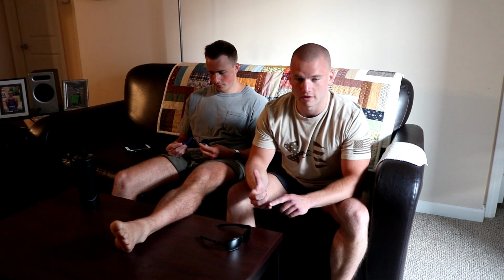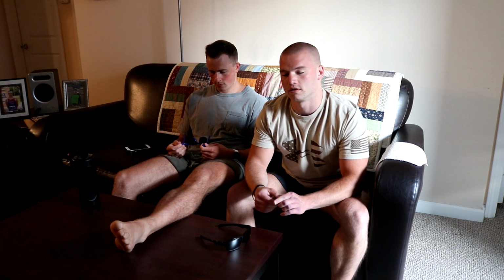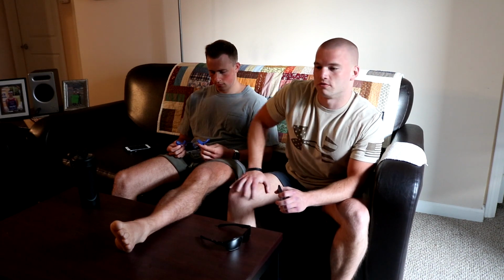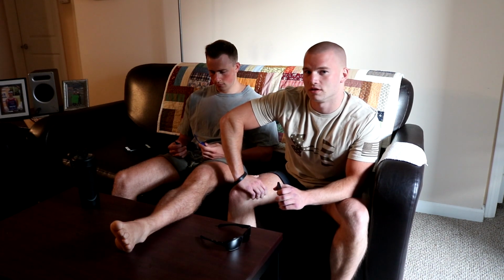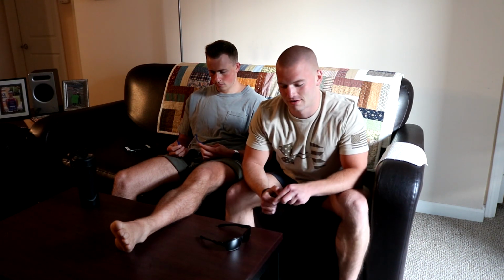Malignancy of any type, radiation therapy within the last 4 to 6 months. You also don't want to apply it over any hemorrhages, the thyroid gland, or other endocrine glands. And then some precautions include if your patient is pregnant. If you're using this on a child who's still growing, you don't want to put it over the epiphyseal plates. Or also if you're working with a patient with impaired sensation, mentation, or increased photosensitization of their eyes.